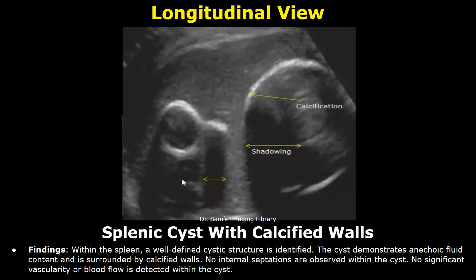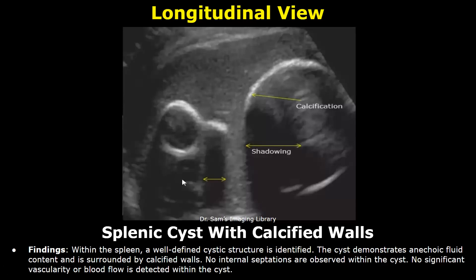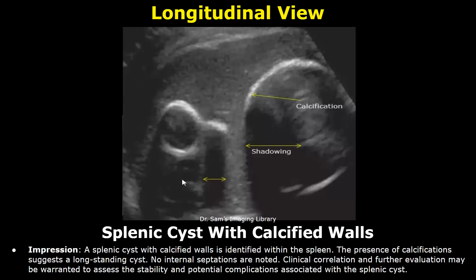Here is a splenic cyst with calcified walls. In the findings, a well-defined cystic structure is identified. It demonstrates anechoic fluid content and is surrounded by calcified walls. No internal septations are observed within the cyst. No significant vascularity or blood flow is detected. In the impression, a splenic cyst with calcified walls is identified within the spleen. The presence of calcifications suggests a long-standing cyst. No internal septations are noted, and in the end the line of clinical correlation is written.